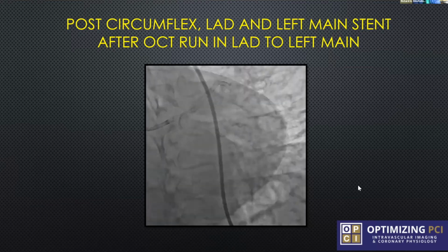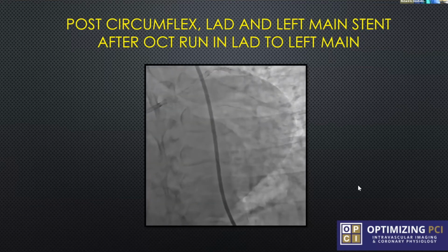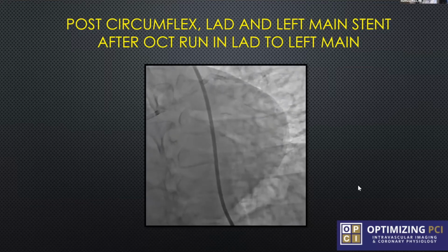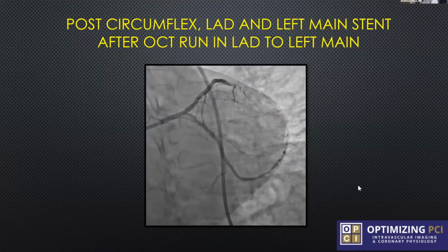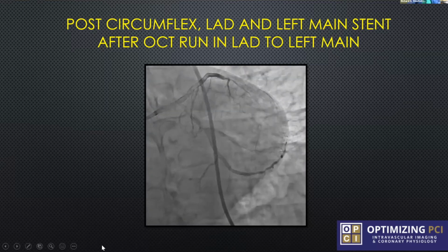This is 2.5 hours. You know how long it usually takes me to do a case, Matt. And this is 2.5 hours. I have 15 more cases. Office is calling, Richard. I'm sorry? Your office is calling you. Everybody's calling me, right? I'm 2.5 hours into it, but I'm going to do my final OCT run.